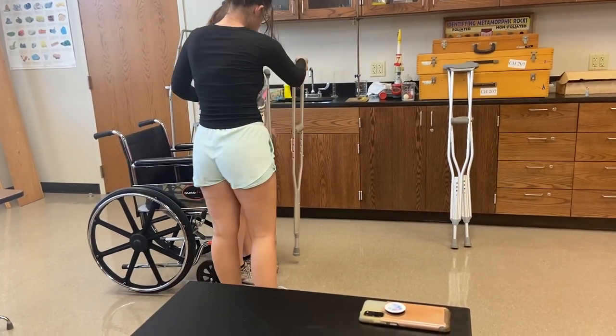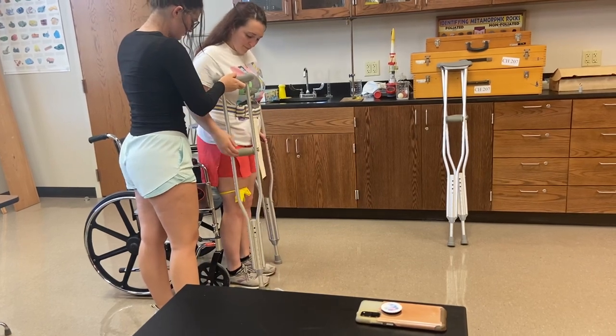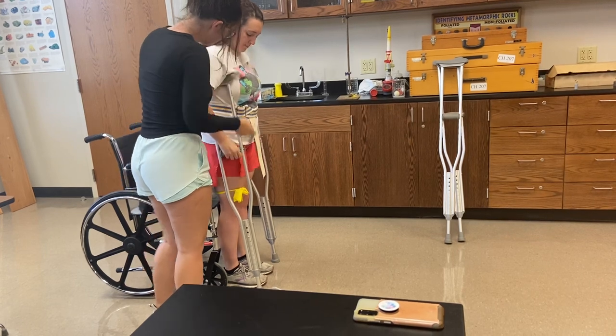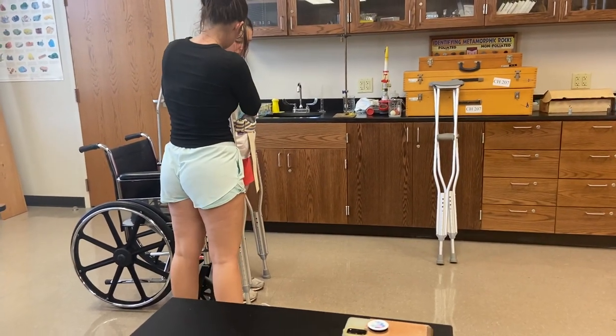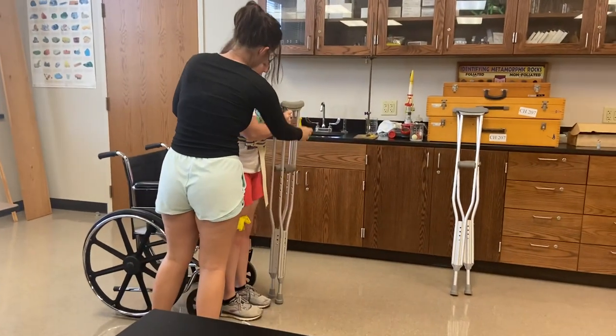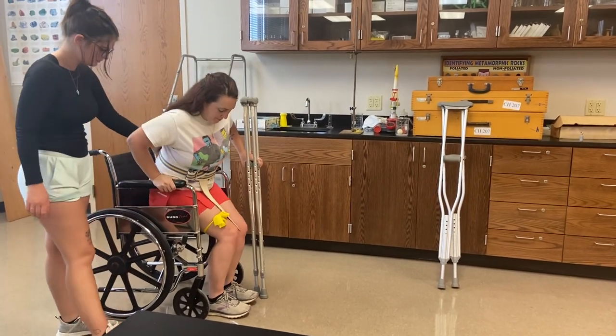So I'm going to take one of these for you and set it right here under your armpit. Does that feel too tall? Yep, I think it is. So we can put that in that hand and I'll have you reach back and sit down.